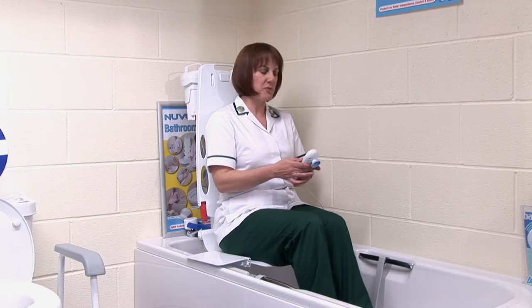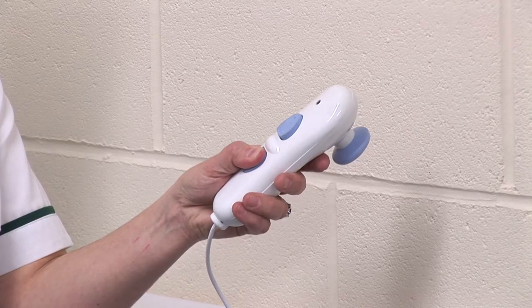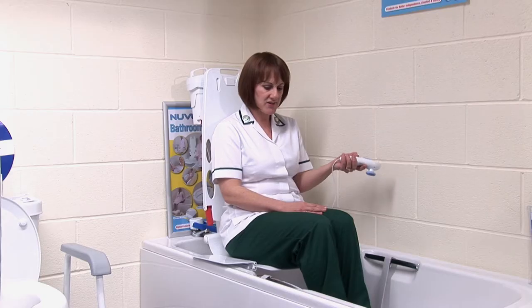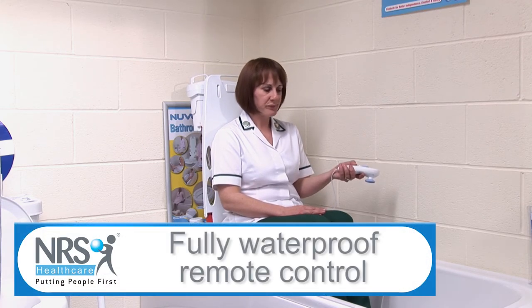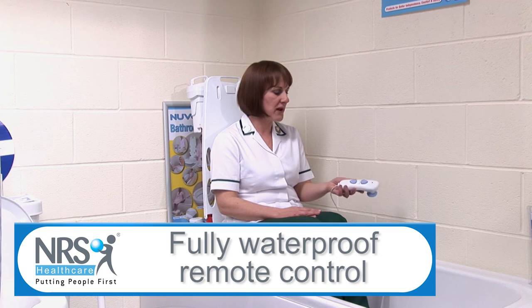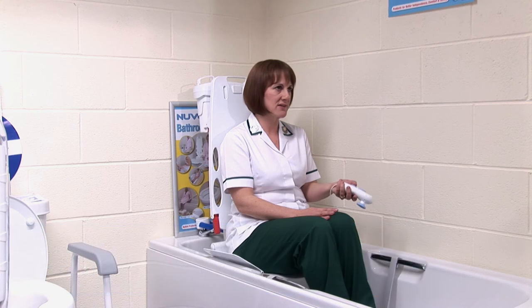Make sure you're nice and comfortable and you feel safe. And then it's simply a question of just pressing the button — you don't have to put much pressure on it — and it will start to slowly lower your seat. Is it safe to use the remote control in the bath? It's completely safe. If you drop it or you have it in the bath, it will float and it's completely sealed, so there's no problem about it getting wet at all.